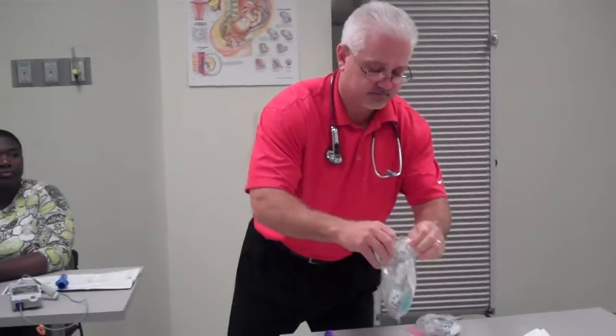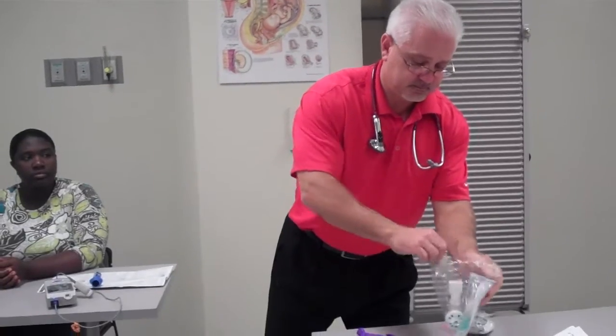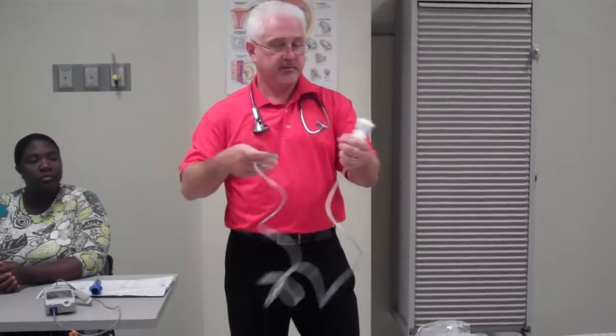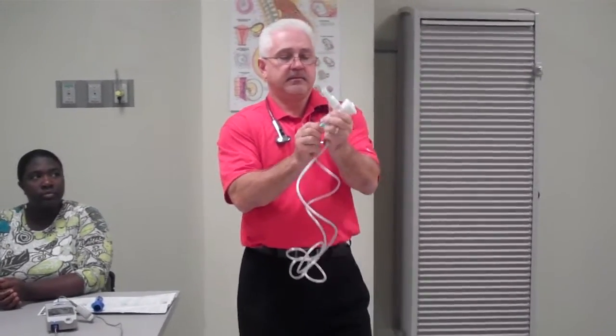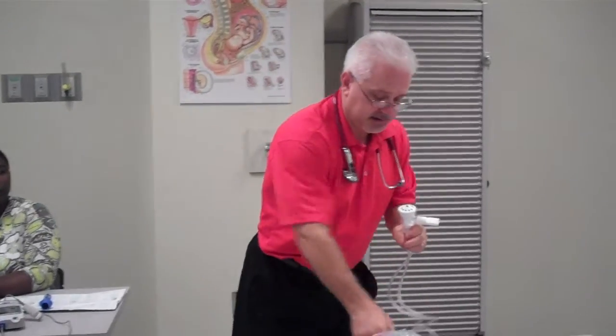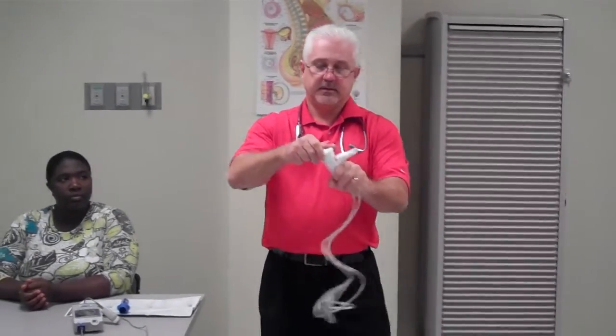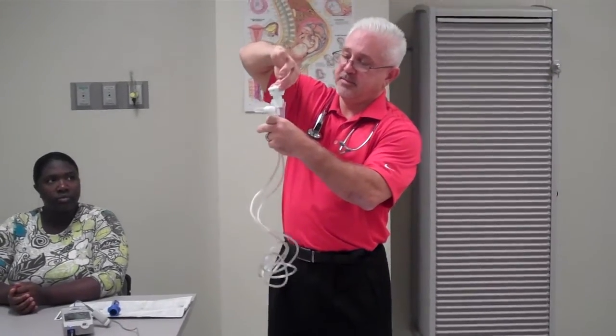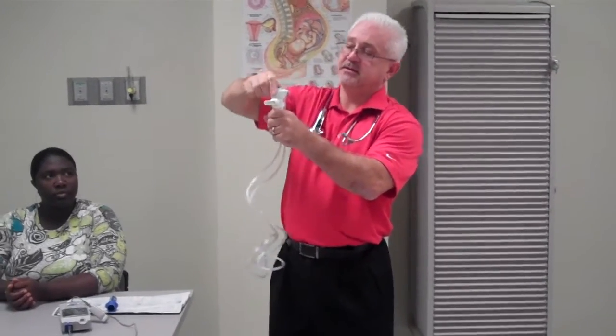I'm going to take my nebulizer, using aseptic technique. Take my medication, open it up. You see how I'm not trying to touch anything on the inside. I put my medication in, full unit dose. Take my top, I put it on, and I rotate it until it's closed.